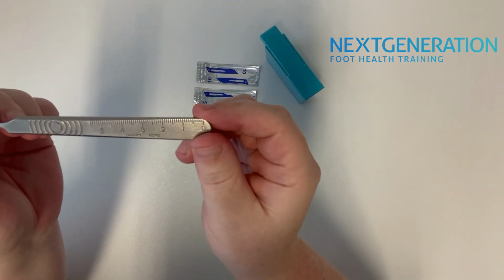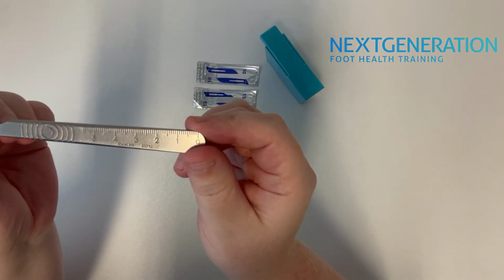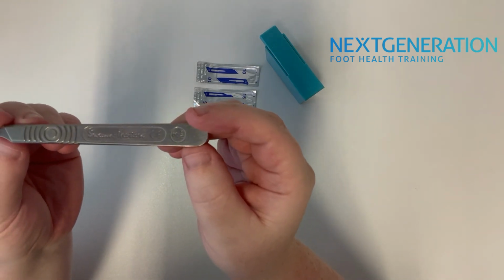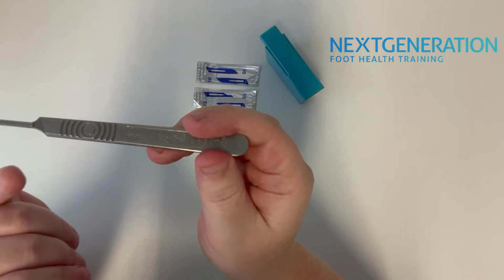So if anybody wonders what that measurement's for, it's just so that you can maybe pop it up against a lesion on the foot or anything like that, just to measure it, take a picture of it, see if it's getting bigger, see if it's getting smaller, should you need to take that picture and refer it on to someone else, a higher-up professional, etc.